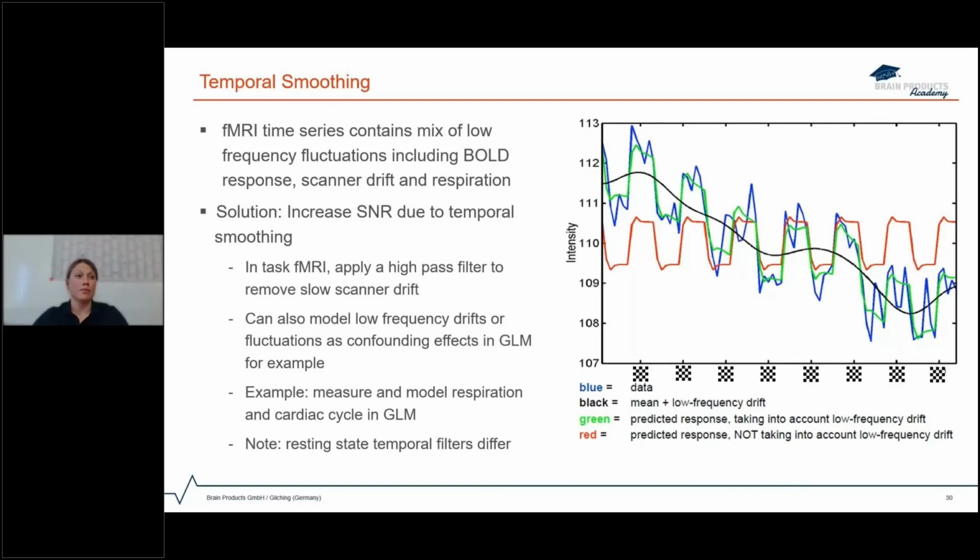But we can also choose to model some of these low frequency fluctuations as confounding effects in the GLM, and that is the statistical analysis that we will cover in more detail in webinar 3. So I will come back to this in webinar 3. Note here that resting state temporal filters do differ somewhat from the ones that we would apply in a task-based design.